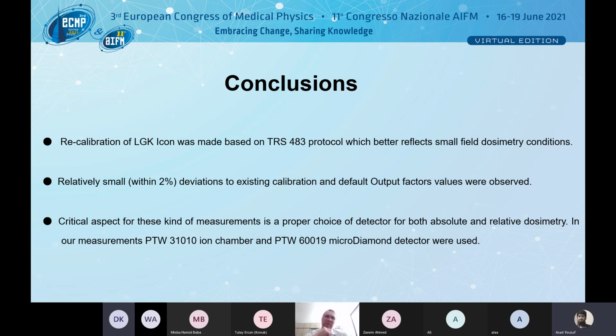I am not really using this new recommendation for any technology other than Gamma Knife. I did commissioning on CyberKnife years ago. I can imagine it's probably easy and very similar to Gamma Knife: find the table with correction factors based on your detector and use them. But I can't comment now for Linac-based. Sorry for that.